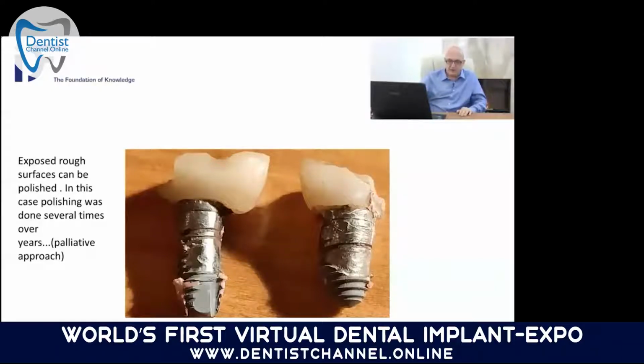And when I took out this implant, I actually called the doctor who put this implant. He said, yes, you know, I did a big job. It was polished several times, again and again. And then I asked him, okay, but let's say next week, you're going to put a polished implant right away, or you're not going to do it? And simply this was the end of the telephone call. There was no answer to this.